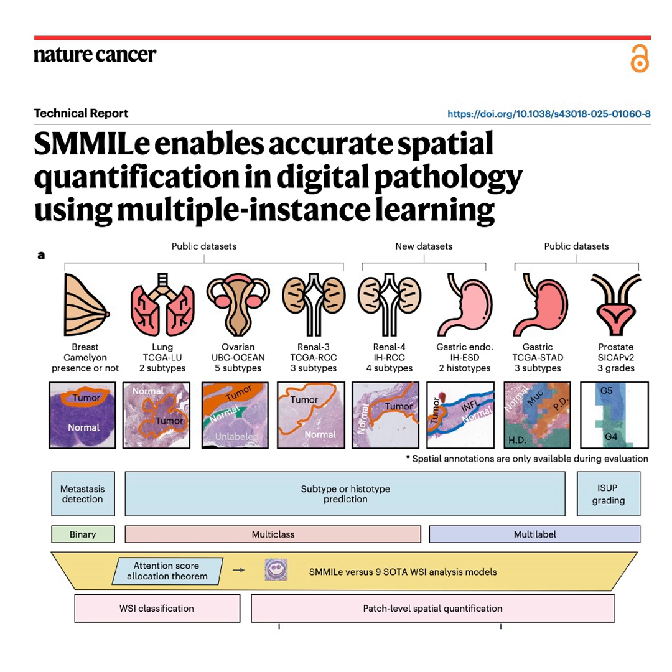You would definitely think so. And to be fair, with Conch, almost all the models improve their overall slide prediction. Most jump to near 100% accuracy in just shouting, "Yes, Waldo is in the city." But, and this is the defining revelation of the paper, they still fail at the cartography. Even with the best foundation model in the world.